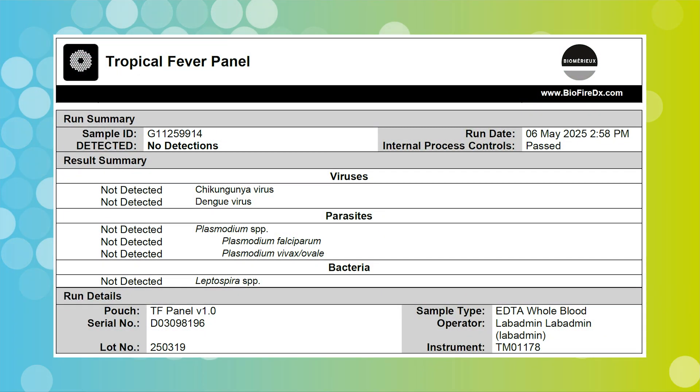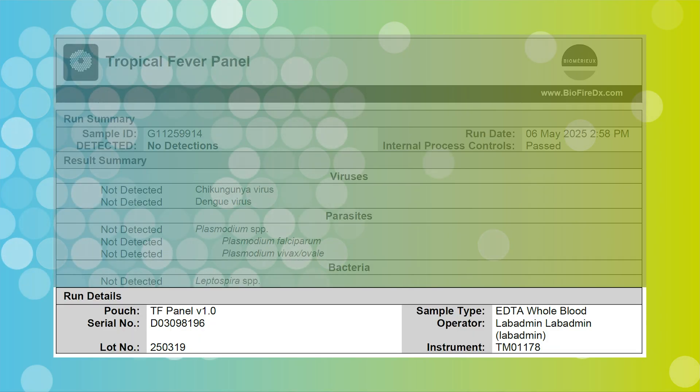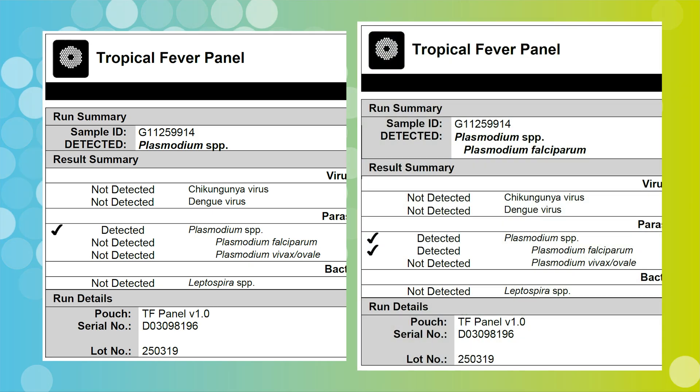The BioFire Film Array Tropical Fever Panel Test Report is automatically displayed upon completion of a run. Each report contains a run summary, a results summary, and a run details section. The panel contains three Plasmodium assays: one genus-level assay and two species-level assays. This test cannot differentiate co-infections other than Plasmodium falciparum and Plasmodium vivax/ovale. Infection with additional Plasmodium species is always possible and should be considered. Refer to the instructions for use for more information.